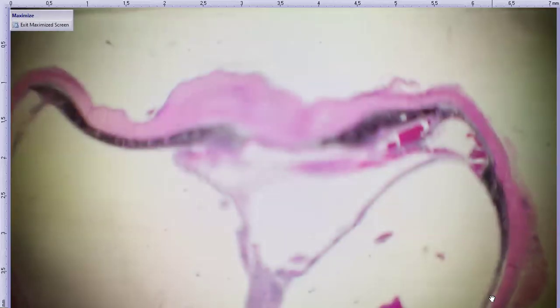Okay, the eye is pointing down here. It'll point up. Oh, I'll do this. It's an oddly shaped eye, so they embedded it differently, or they captured it differently on the slide.